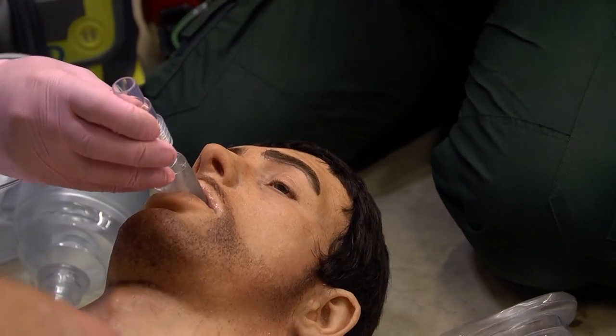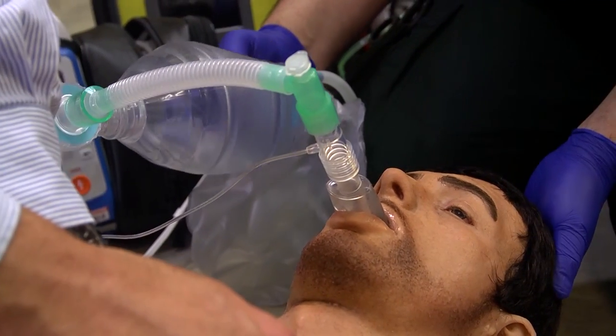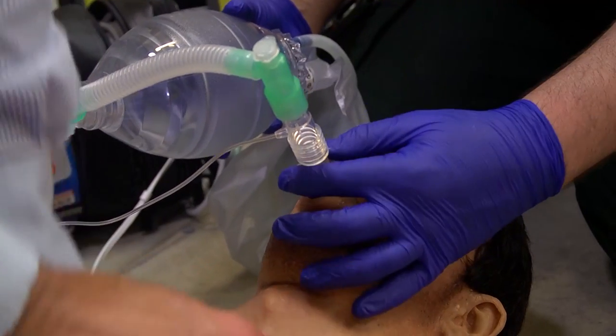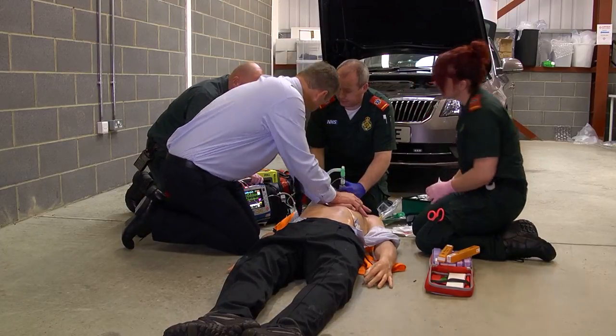Great. Thank you, Andy. That's excellent. So, Jamie, if I can just get you to pause, we'll just do two ventilations and then carry on. That's excellent. Keep going. Okay, good. Are you ready for a rhythm check? Yes, let's do a rhythm check. We're still showing VF, so keep going.